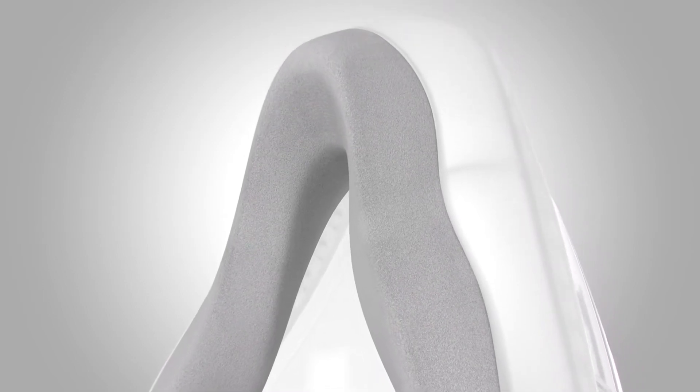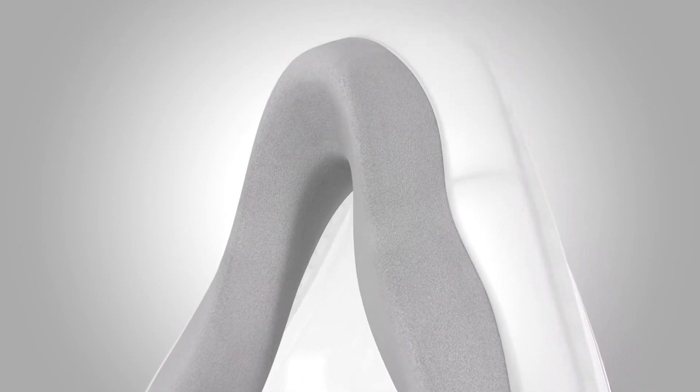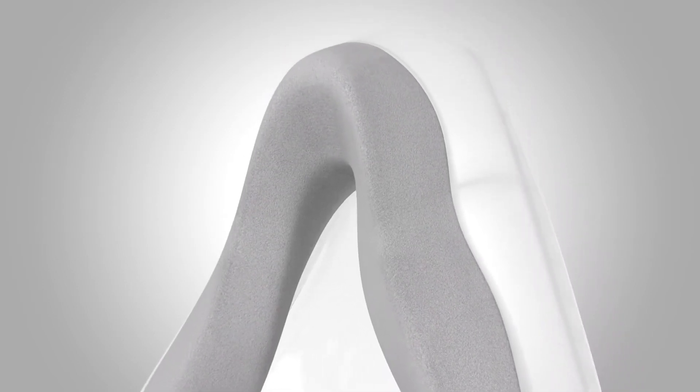crafted from ResMed UltraSoft Memory Foam. Softer than silicone, Memory Foam seals by gently adapting to the contours of a patient's facial profile to deliver an outstanding seal, but with an unprecedented level of comfort.